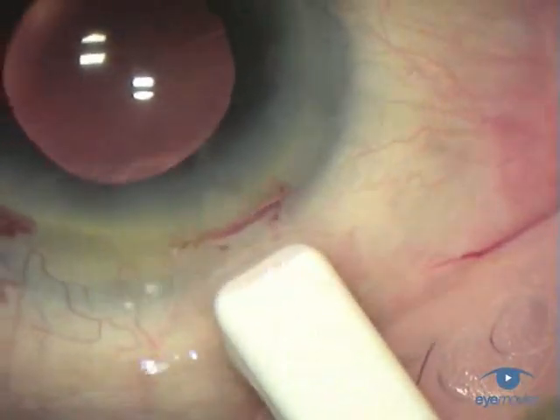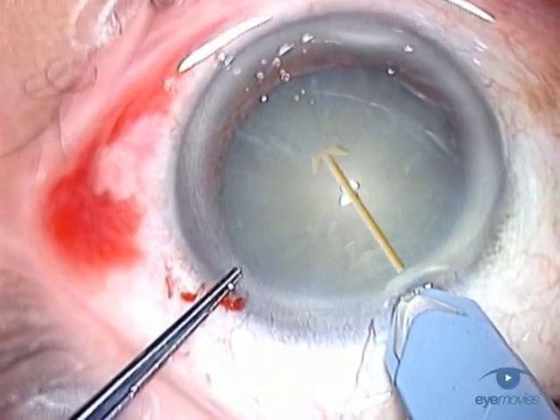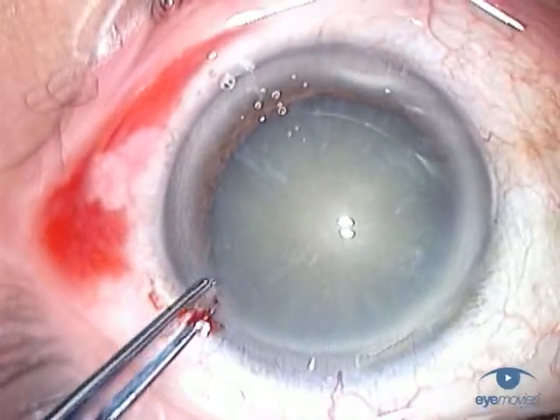However, it was soon realized that a deep pre-groove like this had a significant astigmatic effect, similar to an arcuate keratotomy. You do need to take account of this effect if you choose to use this type of hinge incision.